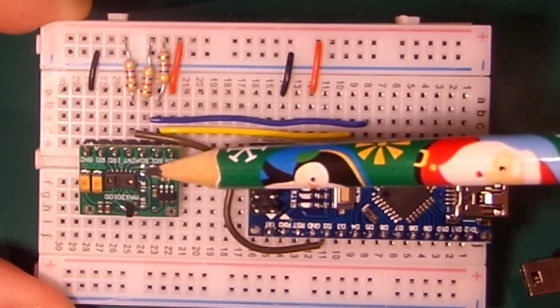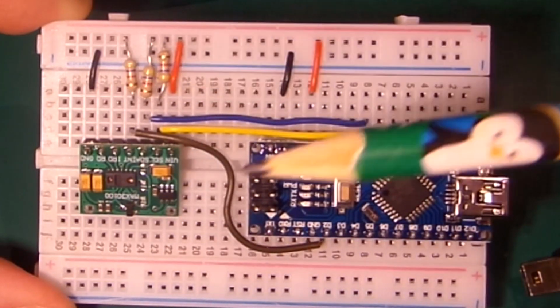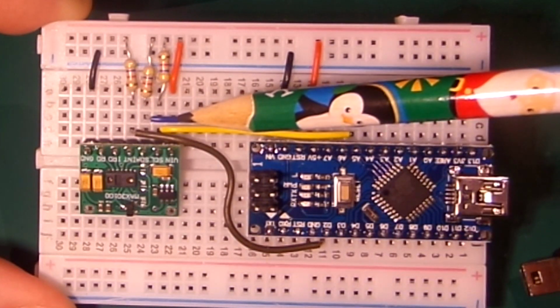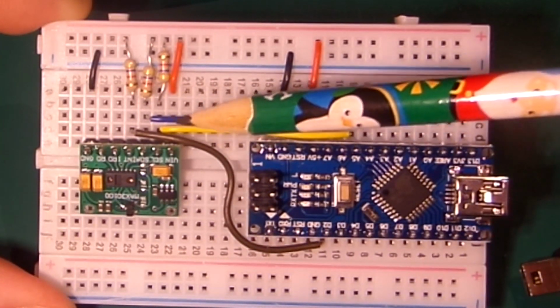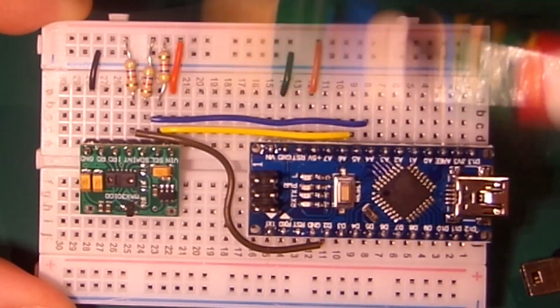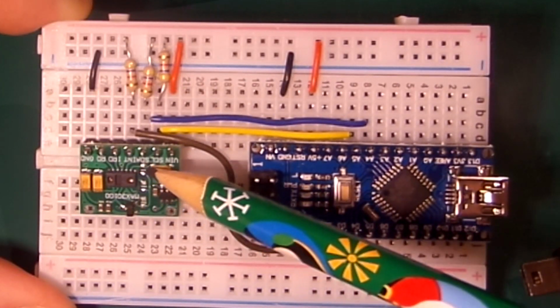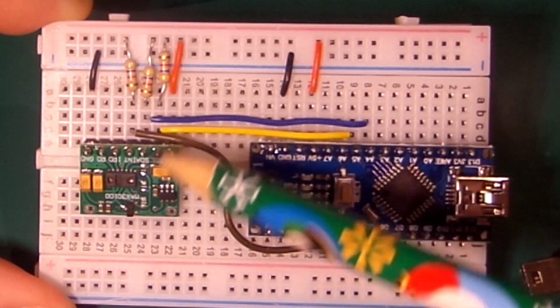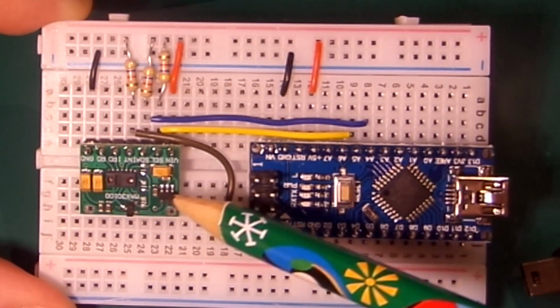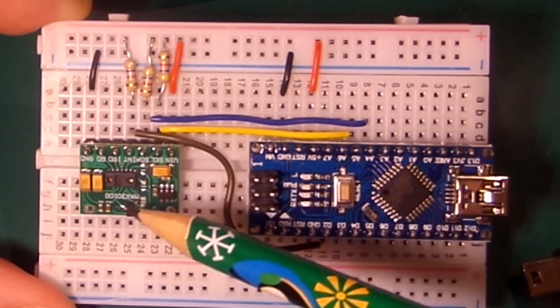So why did we go to the trouble of desoldering 3 4K7 resistors off the board, only to put them externally there? The reason is the Arduino is a 5 volt device, and it expects devices to talk with 0 or 5 volts on this data line for it to understand what the data is. This board was pulling up the I2C lines to 1.8 volts, because this device runs on 1.8 volts and it's got an internal regulator to generate that 1.8 volts, and it will pull it up to 1.8.